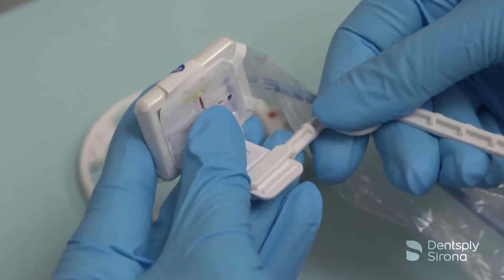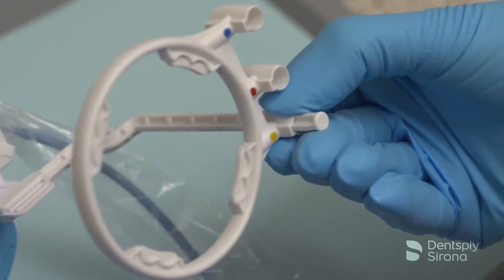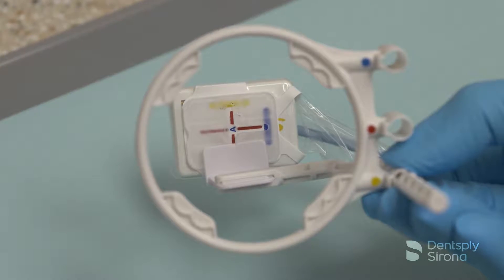After adjusting the bite piece, position the ring on the yellow indicator hole and flip the ring around to accommodate an upper or lower posterior image.